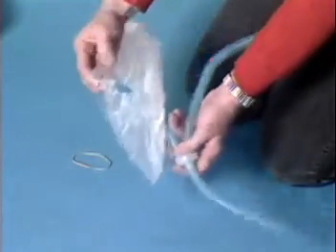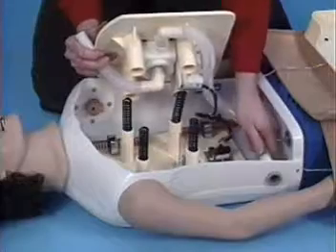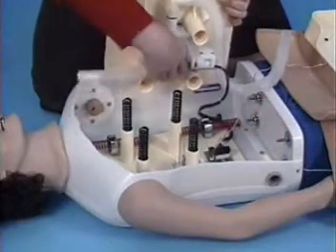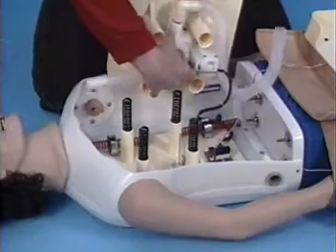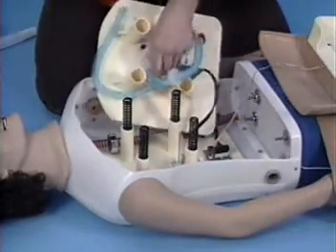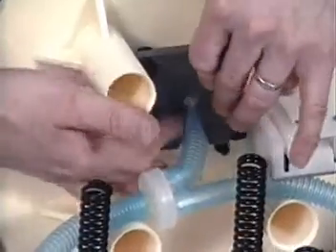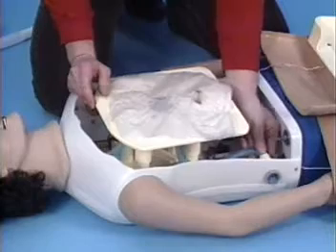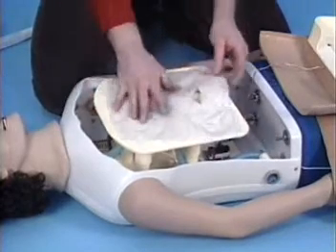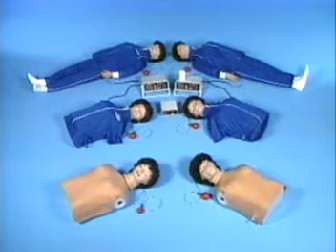Using the disposable lower airway requires no modification of CPARLENE. Simply detach the permanent lower airway from the bottom of the compression plate and from the head and torso. Place the lung bag in the proper position on the compression plate and secure the tubing with the adapter. The ends of the airway are then attached to the head and torso. This same disposable lower airway can be used with the sanitary head or the original head, and with all CPARLENE torsos and mannequins.